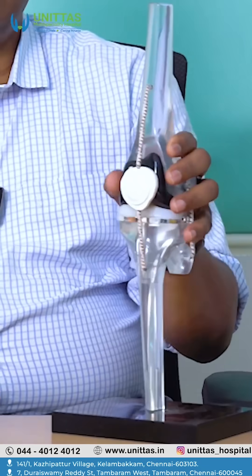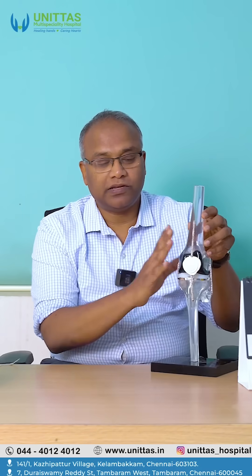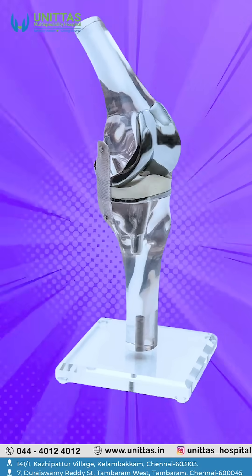I'm Dr. Sudhir, working at Unittas Hospital, Tambaram. We are going to talk today about total knee replacement. If you see the knee replacement, how we do the knee replacement is demonstrated with the help of this model.